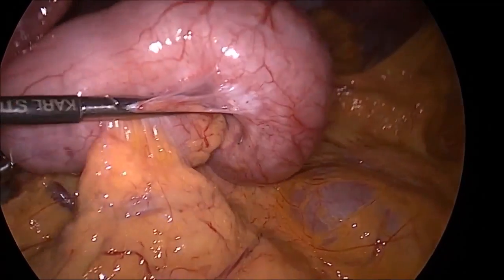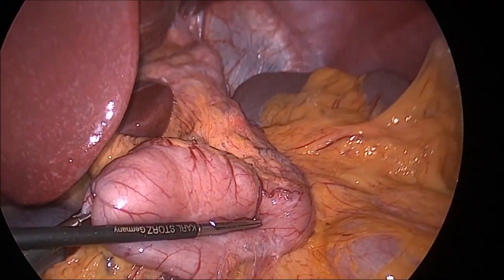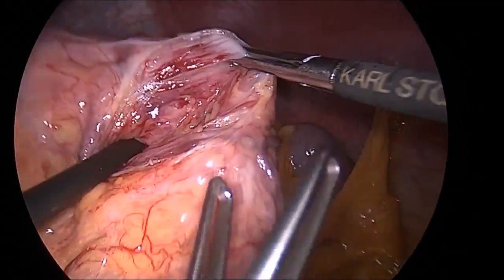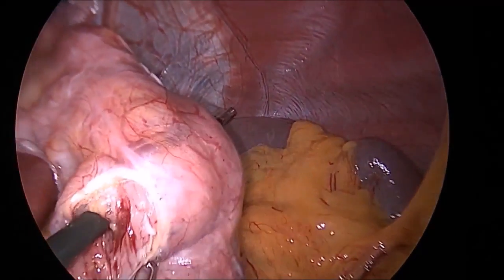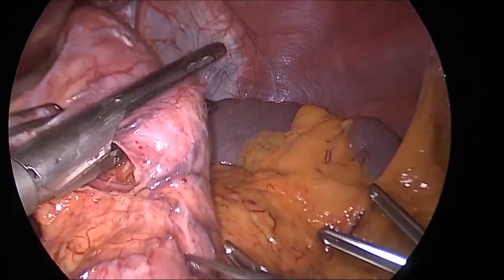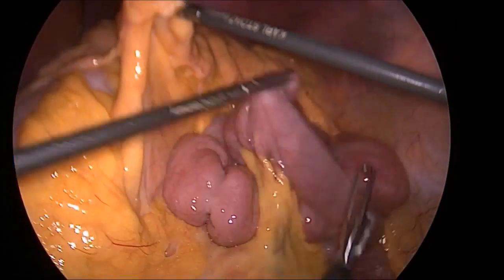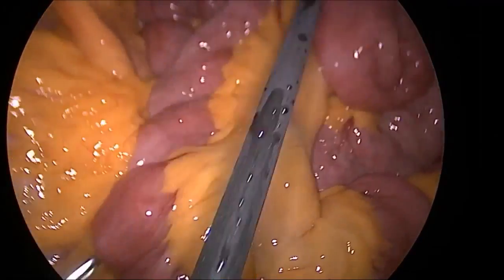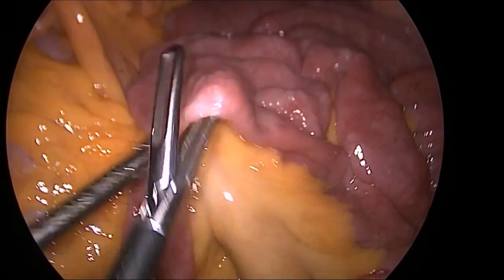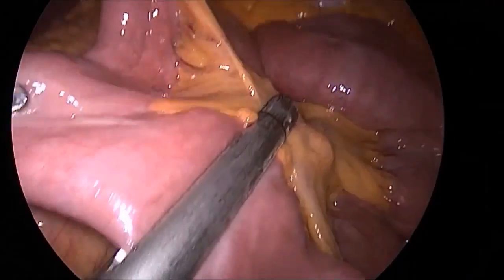We decided to proceed with conversion to a gastric bypass. The endoscope was retrieved after decompressing the sleeve. Then, approximately four centimeters from the gastroesophageal junction, we dissected along the lesser curvature with a blunt technique to create a window behind the gastric sleeve. An endo stapler with a blue load was fired across to create the gastric pouch. The distal staple line along the distal stomach was oversewn with Vicryl. Following that, the transverse mesocolon was reflected, the ligament of Treitz was identified, and the small intestine was measured 125 centimeters from the ligament of Treitz. Another endo stapler with a white load was fired across to create the biliopancreatic limb and the Roux limb.